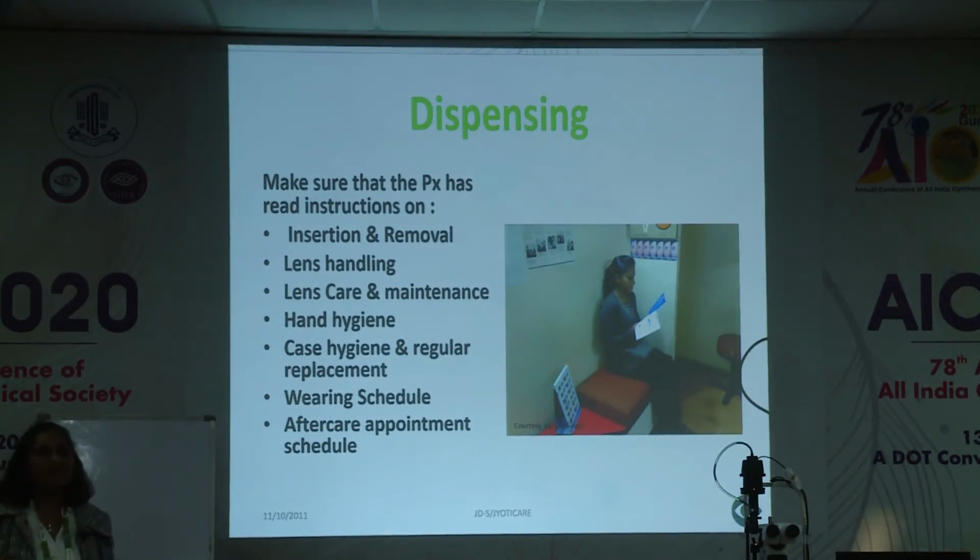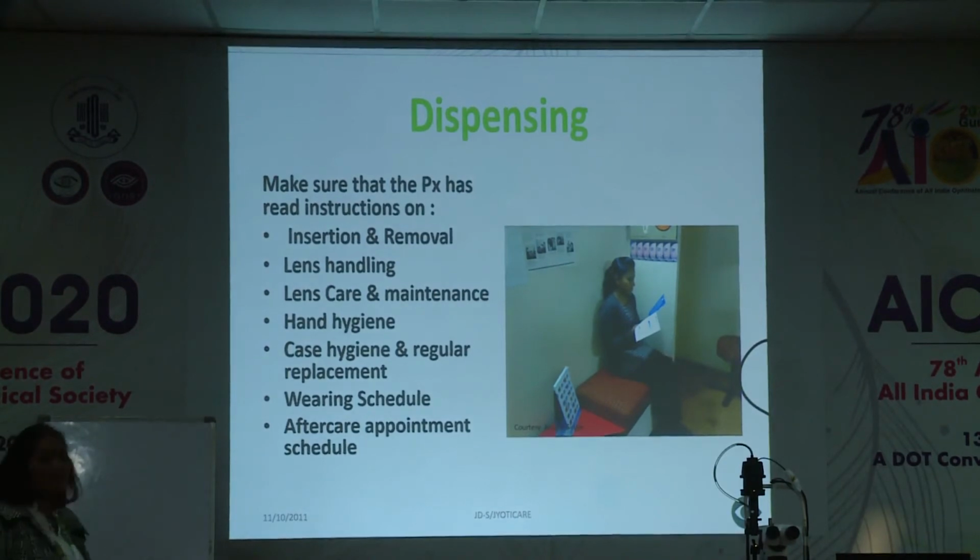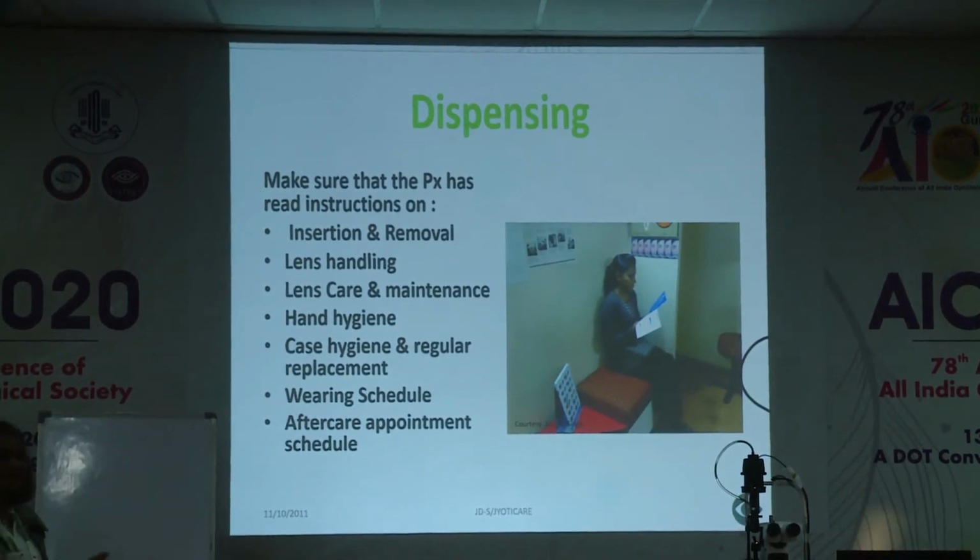So it's very, very important that you tell these patients to make sure that they clean their hands and not to put their hands in their eye at any point or stage. If they feel discomfort, tell them to blink rapidly to create more tears in the eye, and that will help the patient more than actually rubbing the eye. It's very important to give the patient a wearing schedule and an appointment schedule.